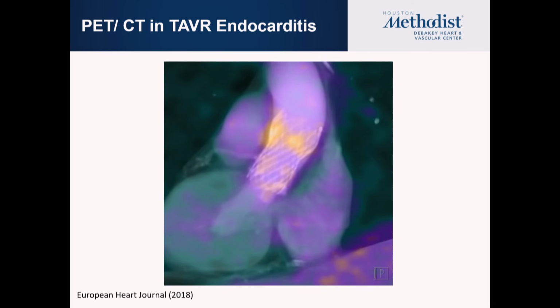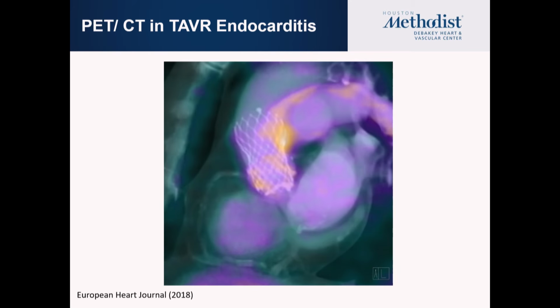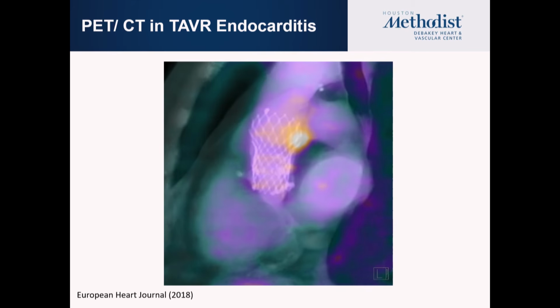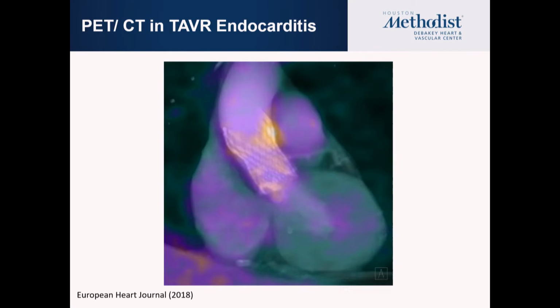Gotcha. And you may have false negatives, especially at the later phase, or with some mild treatment with antibiotics, where you don't have enough bacteria to image them. And obviously, if you have too many bacteria, you probably don't need imaging anyway. The patient would be much sicker and septic. Gotcha. But the same concept which has been applied to the heart, applied to hardware within the heart, is now being applied to other parts of the body, including the aorta.